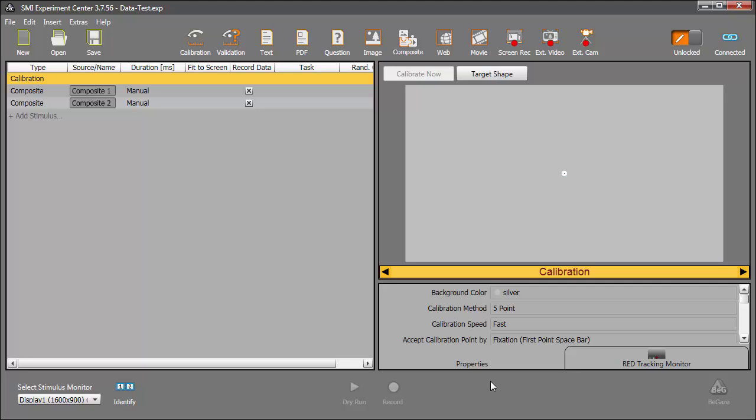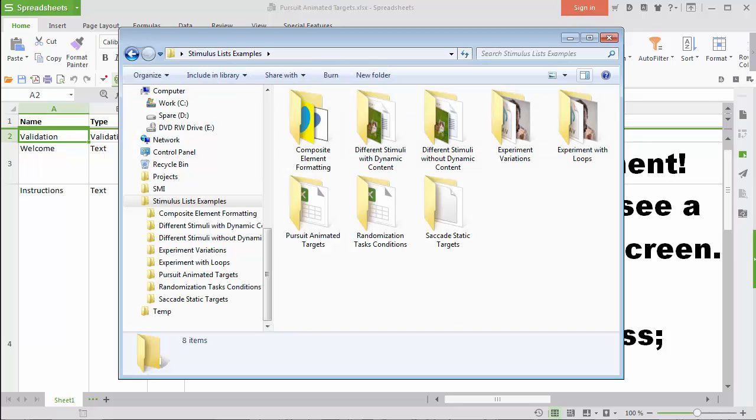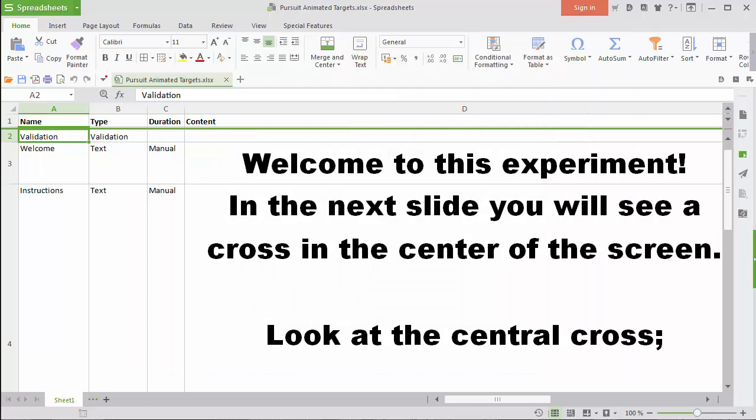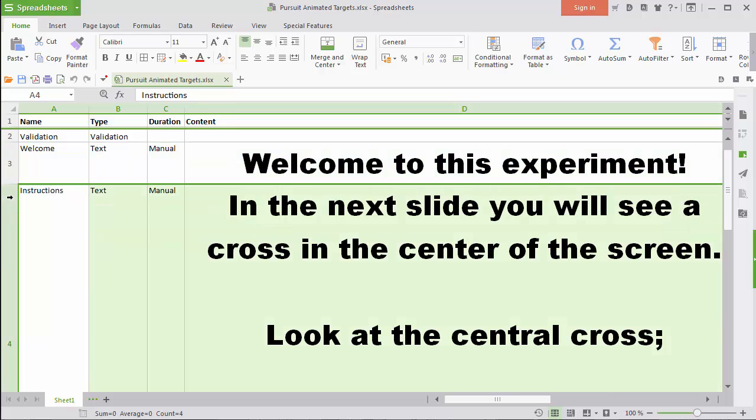In my spreadsheet program, I have an example of a smooth pursuit experiment. All Experiment Suite users have this and the other stimulus list examples, such as one for saccade static targets, available in the StimulusListExamples directory, installed on the desktop by default. You can see how each stimulus is set up in separate rows, from text to composite.